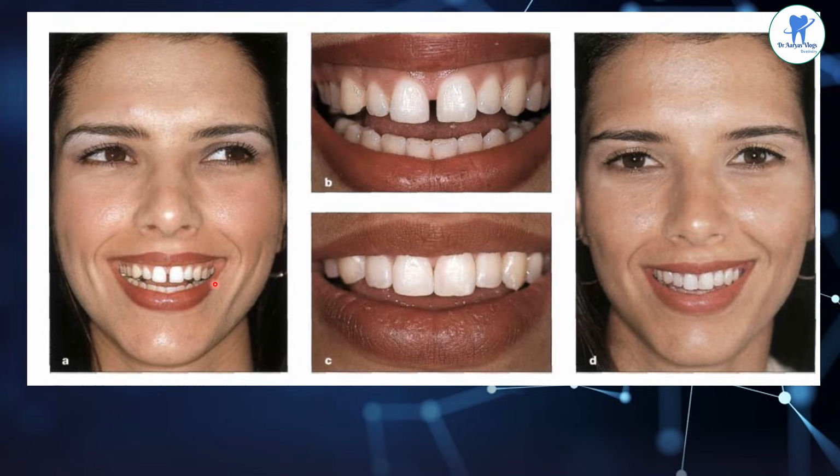Here, this patient is showing a diastema. While closing a diastema, the patient and the dentist should review the final outcome before the final veneers are made. Here the composite mock-ups are the simplest and fastest, and in this way the end result can be seen from the first appointment. The patient gains a full perception including the triangular shape of the papilla between the teeth involved. And the final veneers mimic the contours of the composite mock-up. Through natural integration, the teeth look extremely natural.